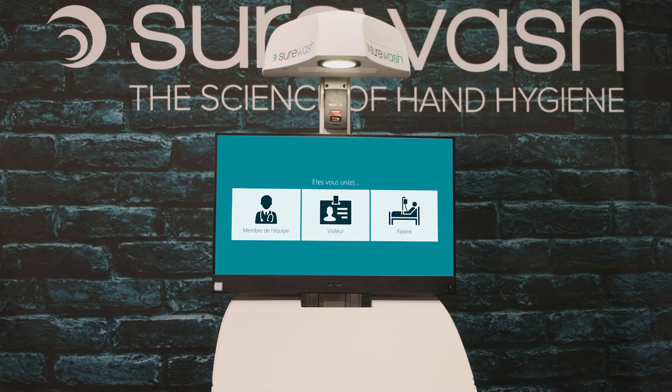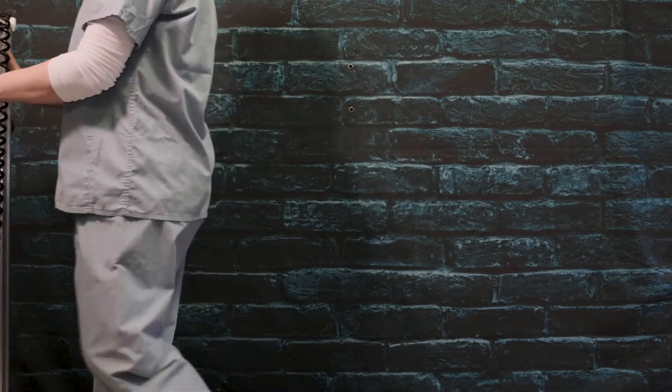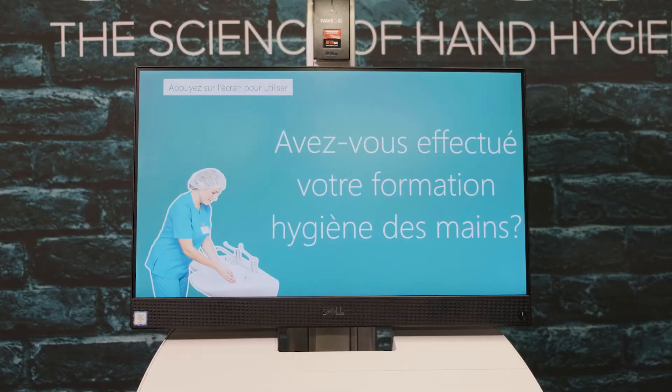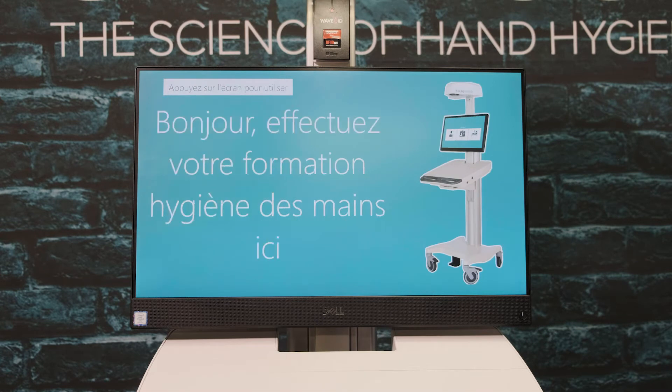The Surewash Elite is an advanced training kiosk that uses augmented reality to deliver hand hygiene training and infection control 24 hours a day, 365 days a year. The Elite is a cart-based system, meaning it is height adjustable and can be easily moved around the facility. The Surewash Elite is available in multiple languages and can be updated with customized messages to encourage interaction.